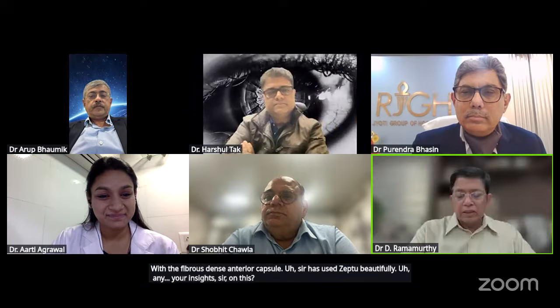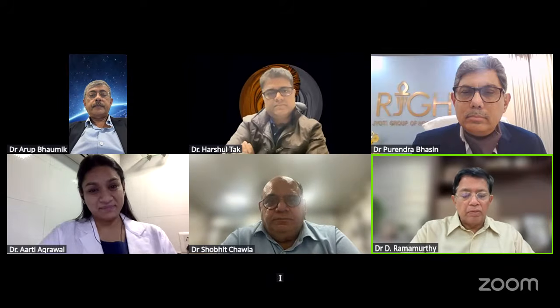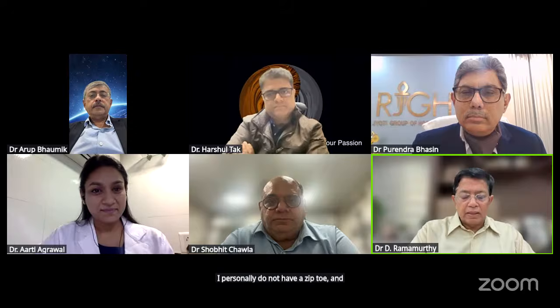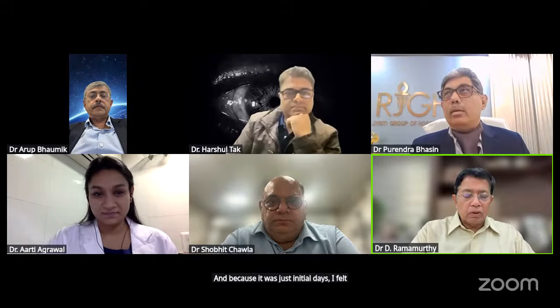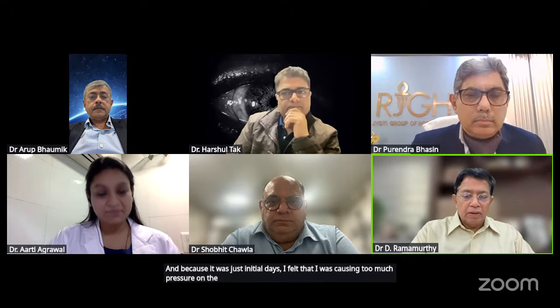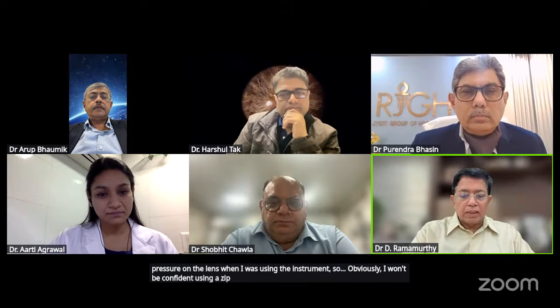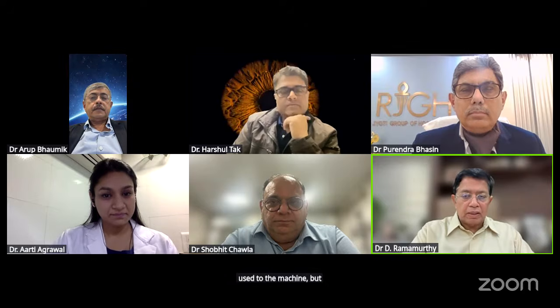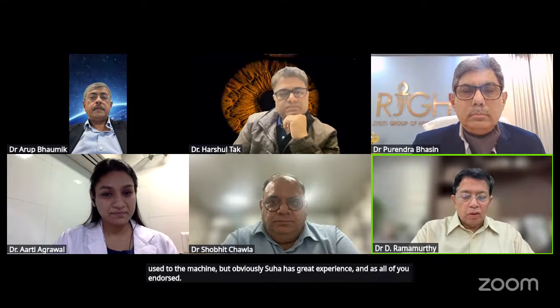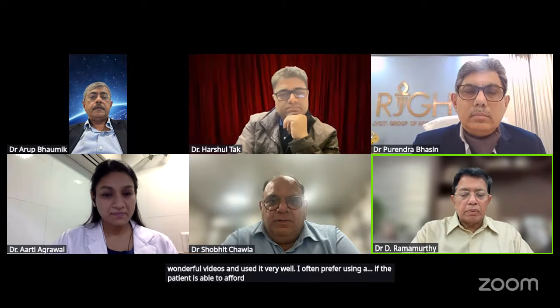No, I think it just shows Suhas's confidence with the machine. I personally do not have a Zepto, and I just had it for a couple of days for a demo. Because it was just the initial days, I felt that I was causing too much pressure on the lens when I was using the instrument. So obviously, I won't be confident using a Zepto on a subluxated cataract because I'm not very used to the machine. But Suhas has great experience, and as all of you endorsed, wonderful videos, and he used it very well. I often prefer using a LRCS platform on this, if the patient is able to afford it.